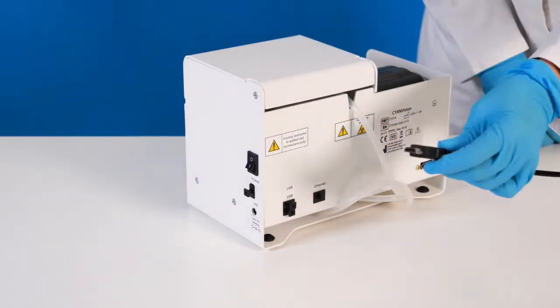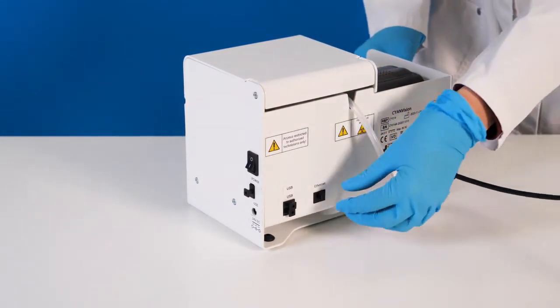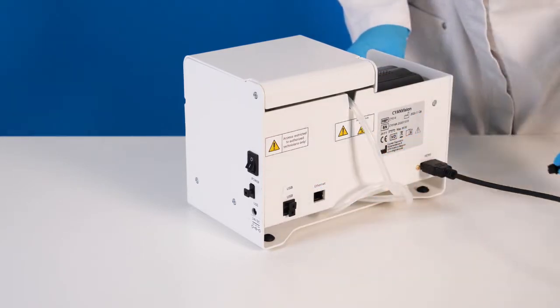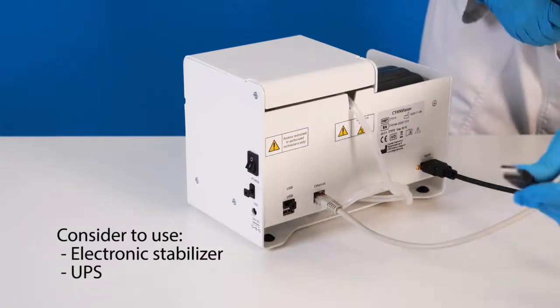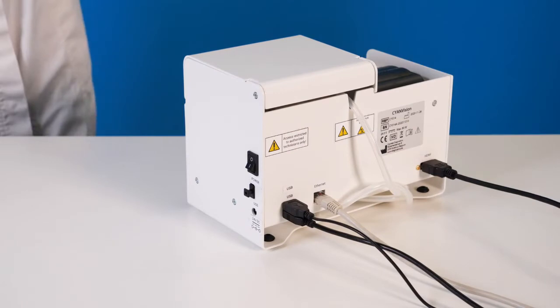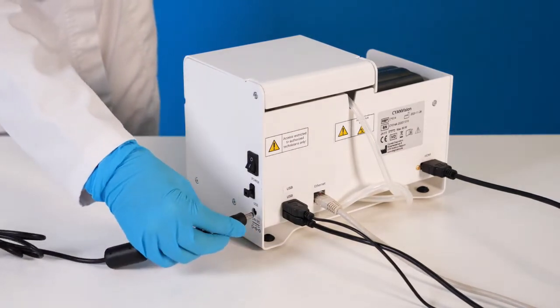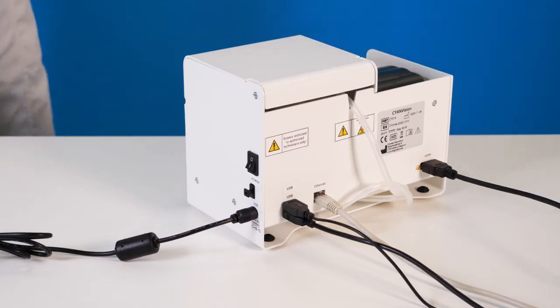Ensure the device is turned off before connecting the peripherals. If you connect the peripherals when the device is on, you will have to restart. Connect the power supply, and ensure that the power outlet you use is grounded. Do not use power extension cables, to avoid unstable current or accidental disconnection.